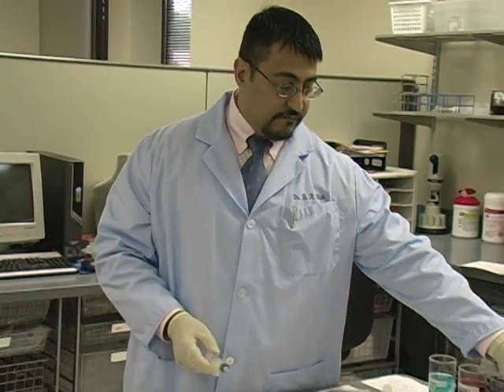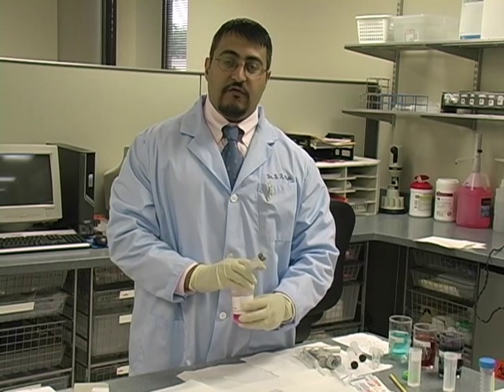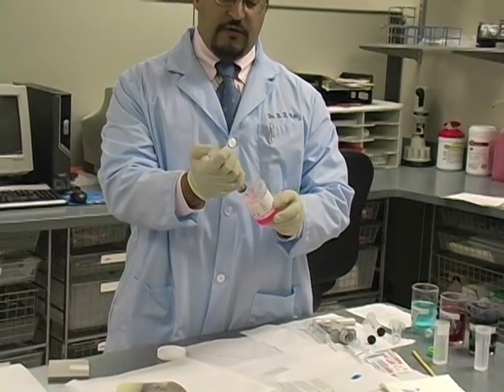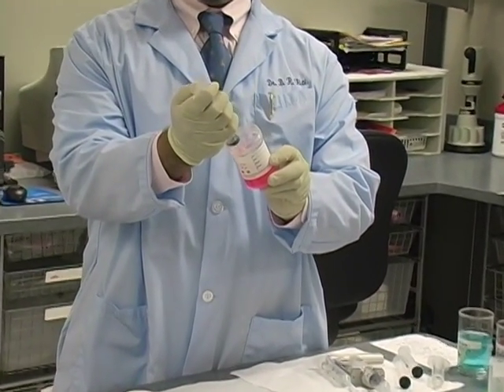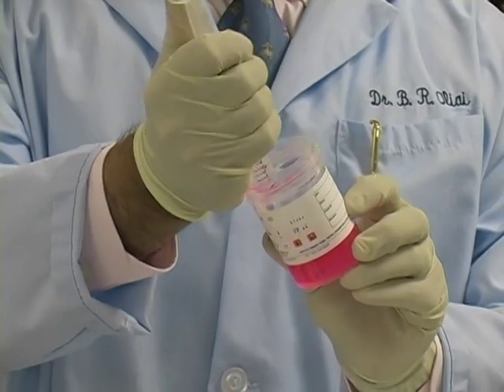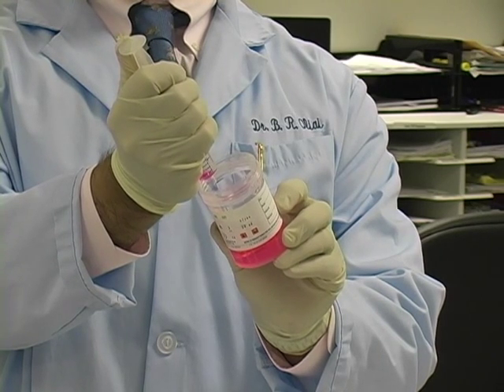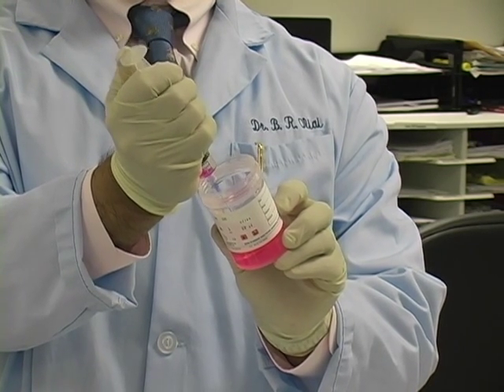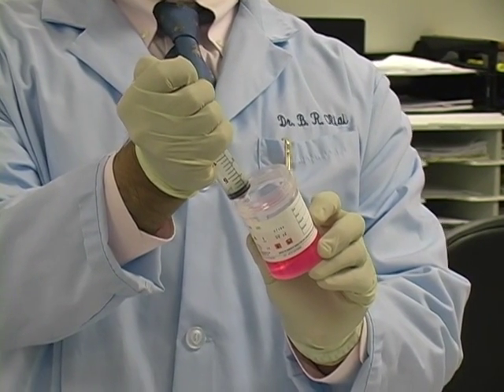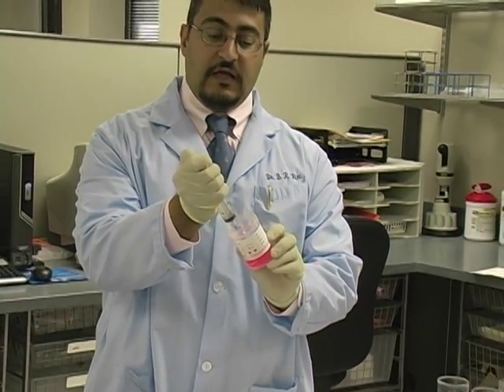After we've done our smears, we have the material in the hub. Optimally it's better to do it quicker, but I was showing the hair dryer technique. You just take the syringe as it is with the plunger, put it in the container, pull up on the suction, and let the cytolight or cyto rich red percolate in the bottom of the needle — rinsing the material in the hub. Then I just express it, spraying all the cells residually left in the hub and in the needle into the material.